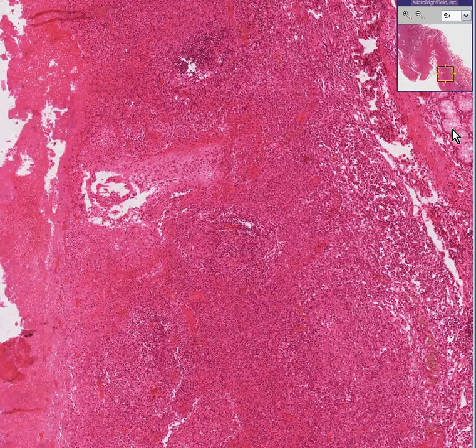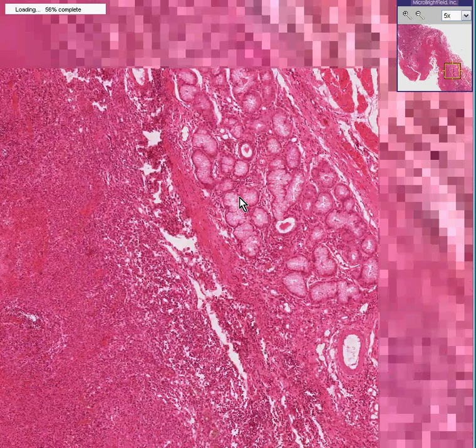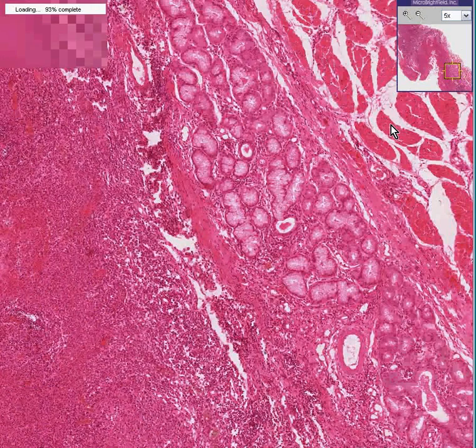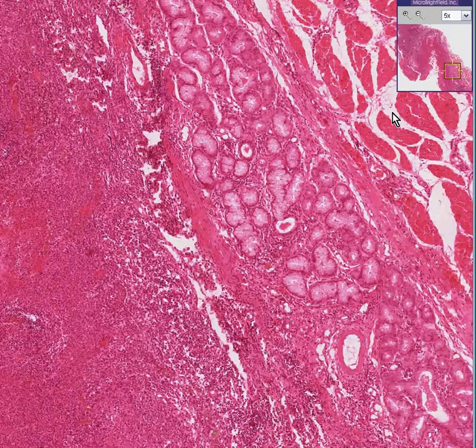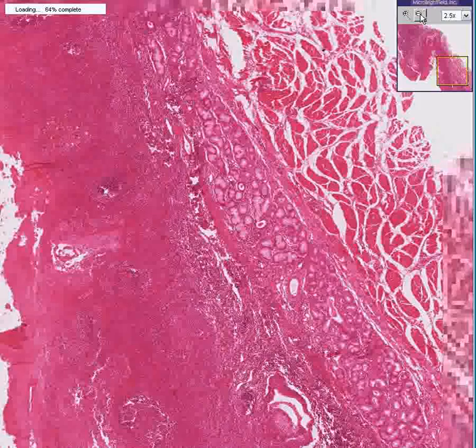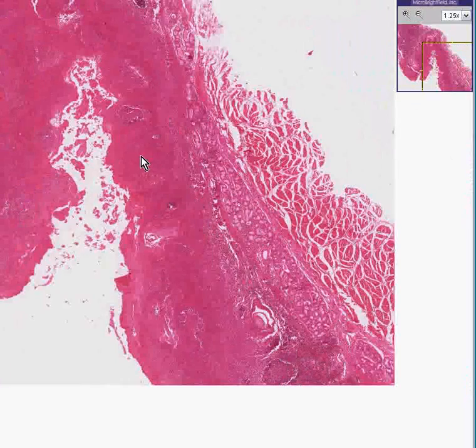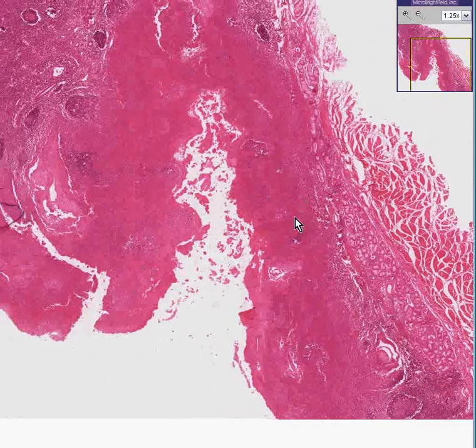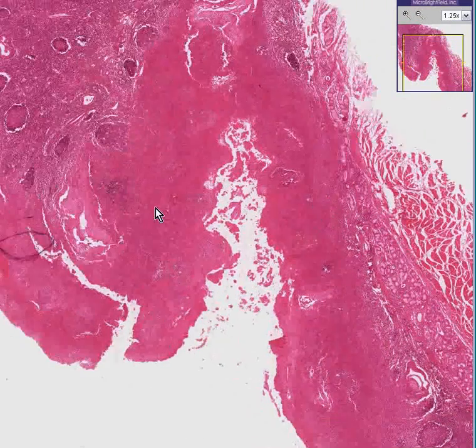Underneath, we see some mucus-secreting glands, and underneath that, we could see some classical skeletal muscle fibers. But what we see mostly is the fact that this organ is kind of lymphoid, and here are all the lymphoid follicles.